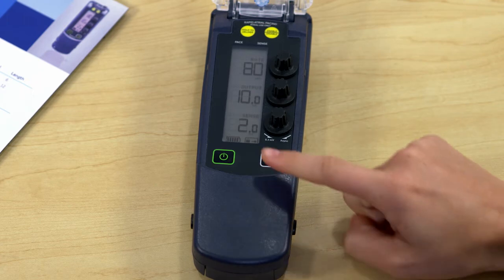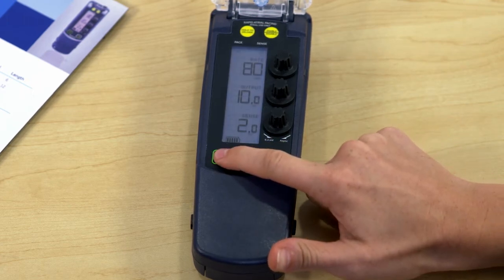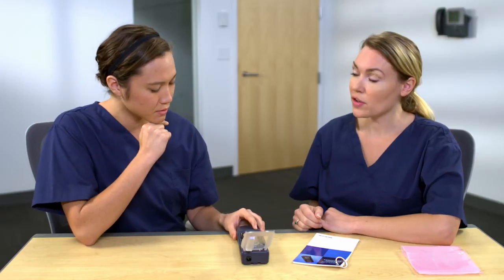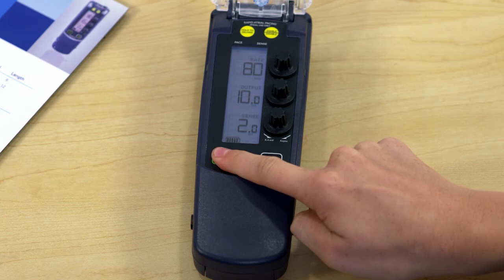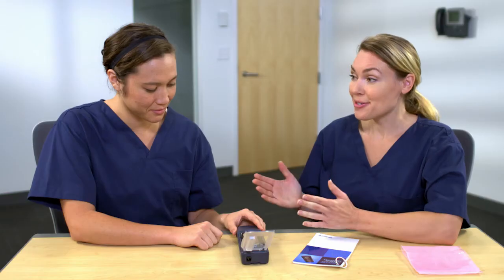Now one more step to practice with the user interface — let's turn the device off. First, I'll need to unlock the device. Then press the on/off button. It's not turning off. To turn the device off, you need to press and hold the on/off button for a minimum of two seconds. Now it's off. This concludes our training session on the user interface and single chamber pacing.